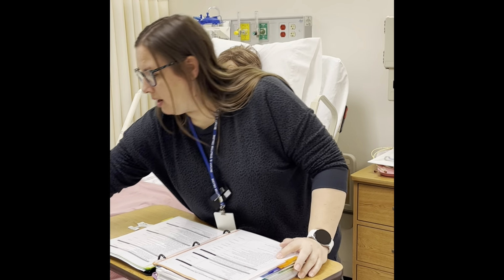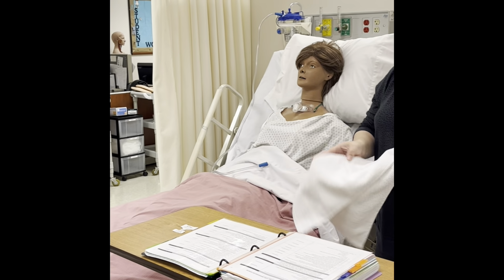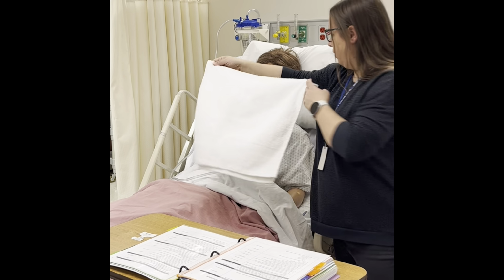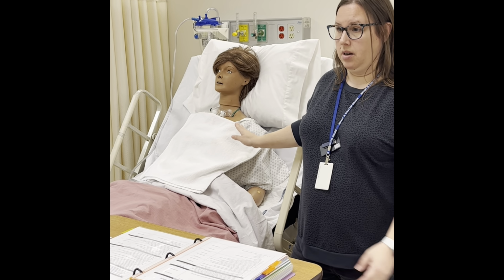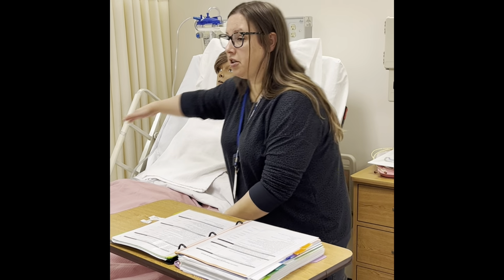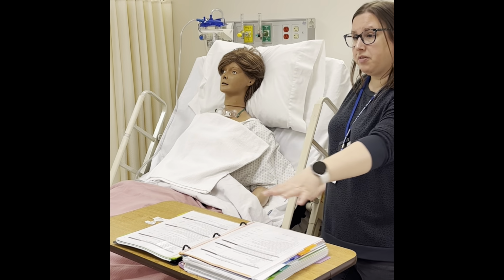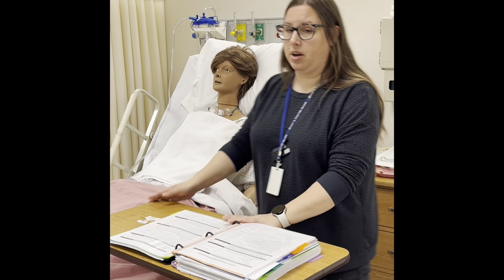So we did that. The next one is to place the towel on top of the client's chest. The reason we're doing that is to protect our client in case they throw up, right? In real life, I would put chucks, probably chucks all the way down, maybe off the side of the bed. Or if our patient's gonna puke, they're gonna puke, which goes with the next one.